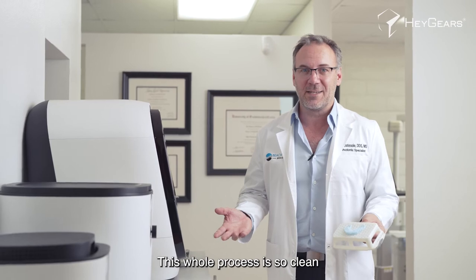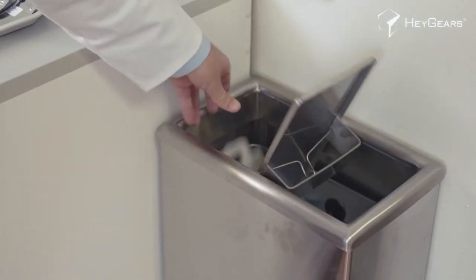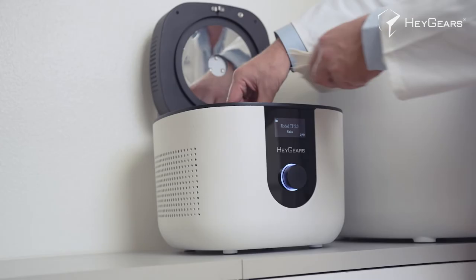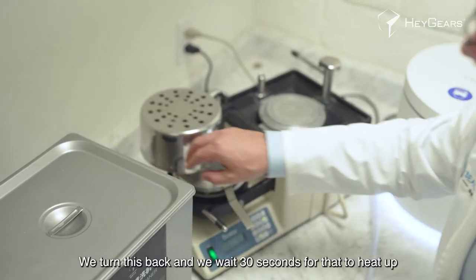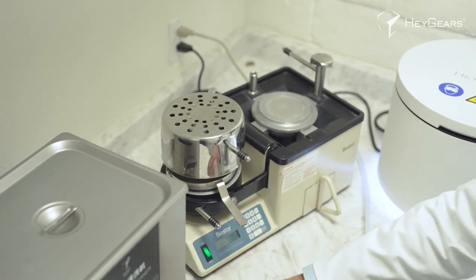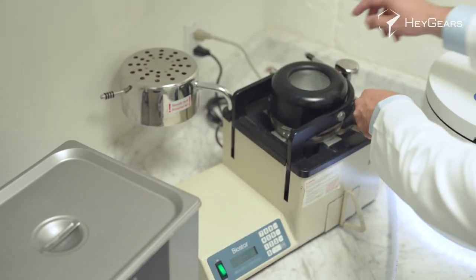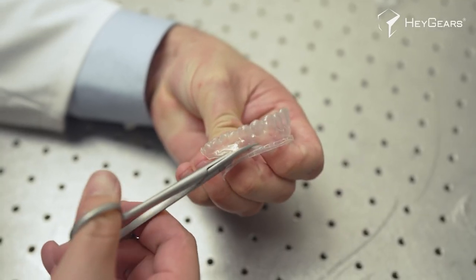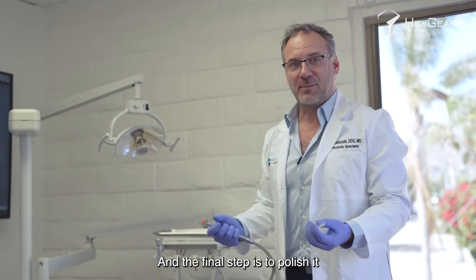This whole process is so clean — you'll notice I didn't even wear gloves. We turn this back and wait 30 seconds for that to heat up. And the final step is to polish it.